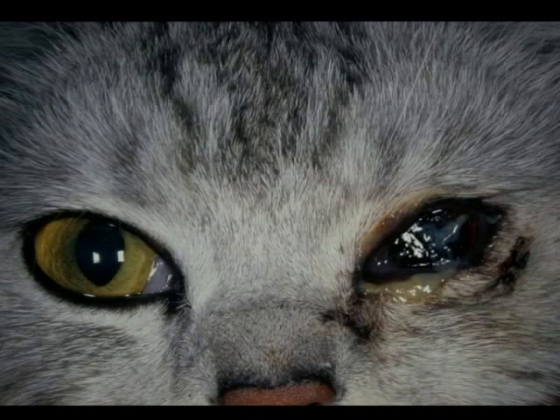Schirmer tear test results should also be viewed with caution in assessing tear film problems in cats. In cats, the Schirmer tear test is much less reliable and more difficult to interpret. I've seen normal eyes, normal corneal health and comfort, and tear production of 5. If one eye was uncomfortable and the other eye was comfortable and they both have the same tear reading, I don't think you can attribute it to a dry eye problem necessarily.